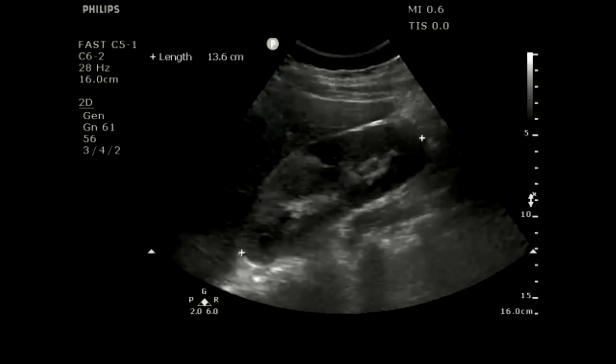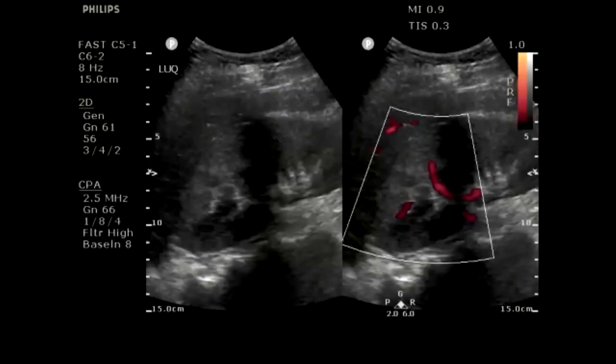You can throw some color Doppler on there — the problem is you're going to see decreased vascularity in both infarction and pyelonephritis anyway, so it may not be the game changer. But the other thing to think through where ultrasound is going to be helpful is: are there any findings of a renal abscess? In this situation no, but keeping your eyes out for those secondary corner clues may be helpful.